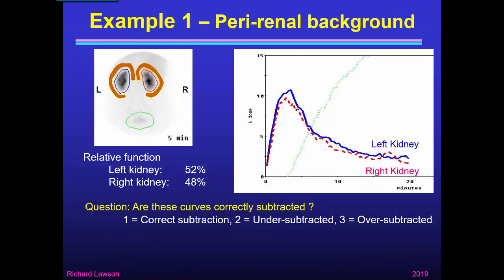Let's take a different background. This is the same renogram but using a perirenal background — this C-shaped region around the left and right kidneys. This allows us to apply a different background subtraction to each kidney, because we have two background regions rather than just one. You can see that the relative function has hardly changed — it's still very close to 50-50. But what do you think about these curves — are they correctly subtracted?